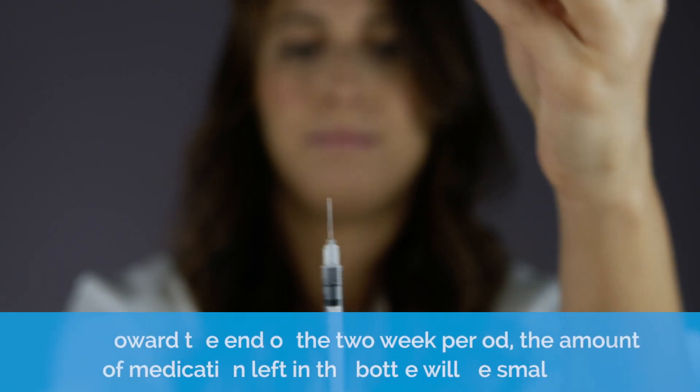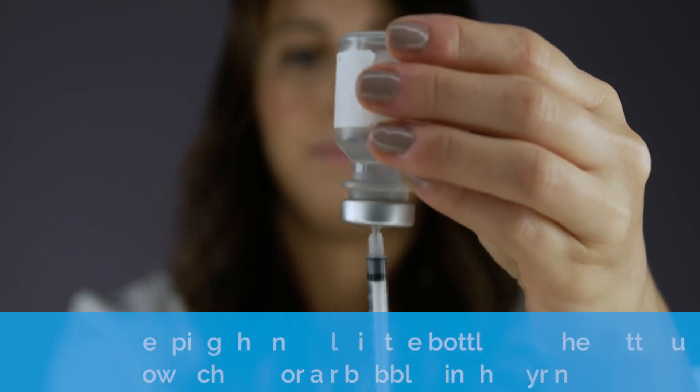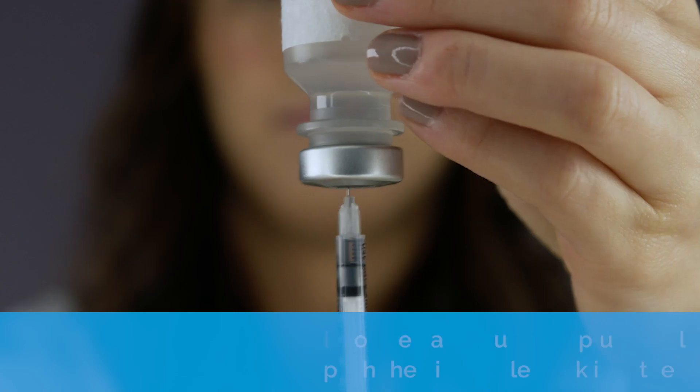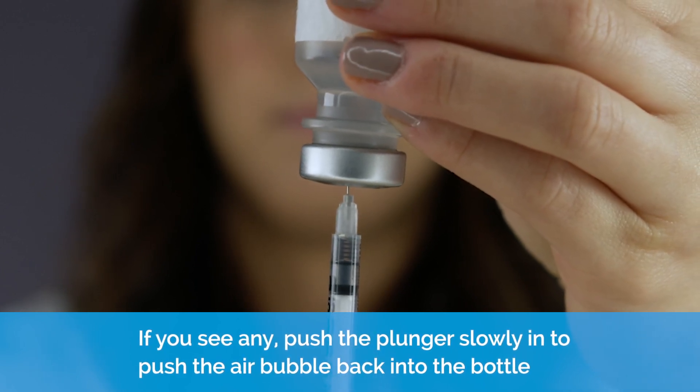Toward the end of the two-week period, the amount of medication left in the bottle will be small. Keeping the needle in the bottle and the bottle upside down, check for air bubbles in the syringe. If you see any, push the plunger slowly in to push the air bubble back into the bottle.